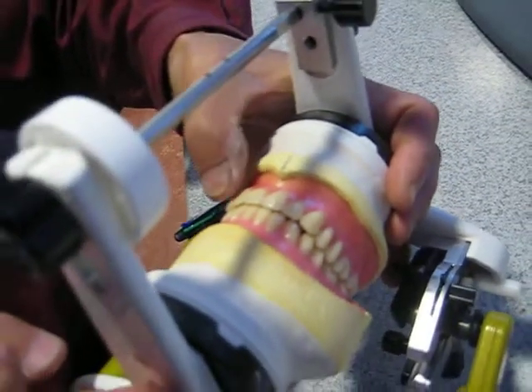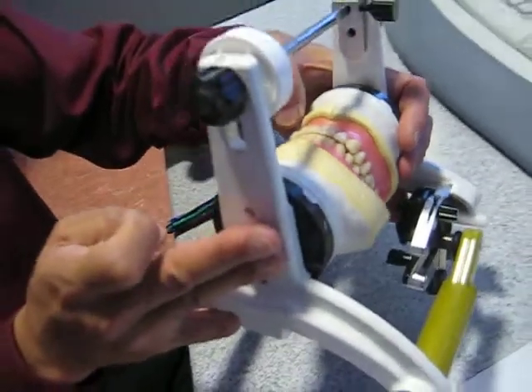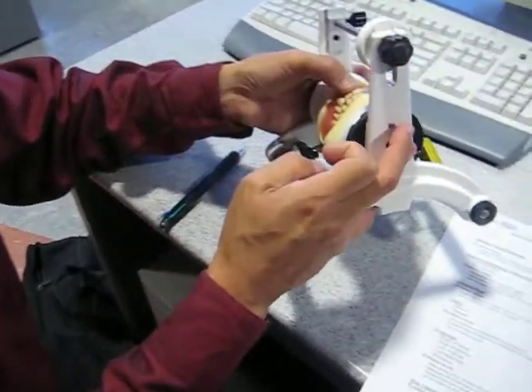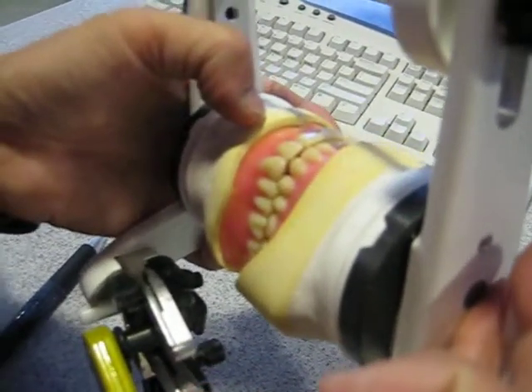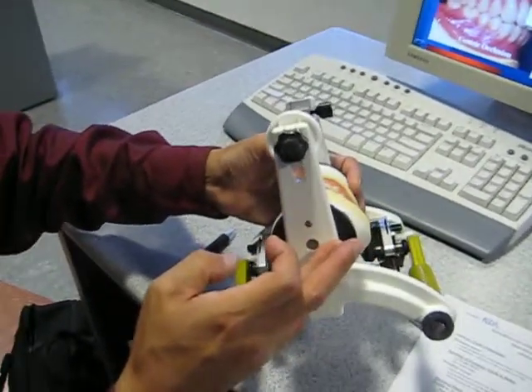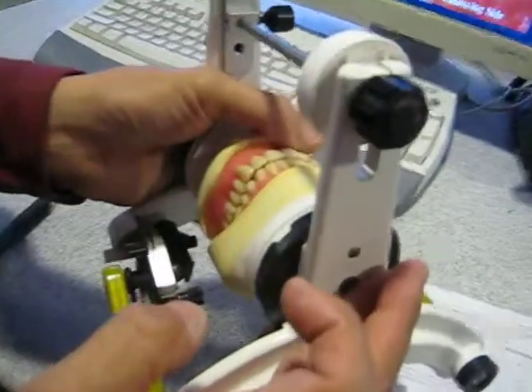Okay, so we want to take a look at that real closely. So I would say that the horizontal overlap is a little bit deficient, primarily on the distal of tooth number 8. But the consistency of the horizontal overlap is relatively good. If you compare the right side of the patient to the left side of the patient, you notice a little tighter on the right side.